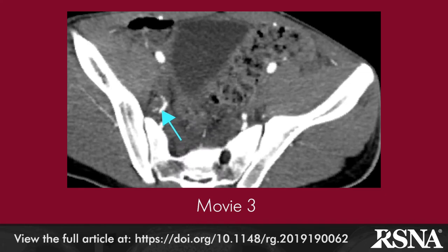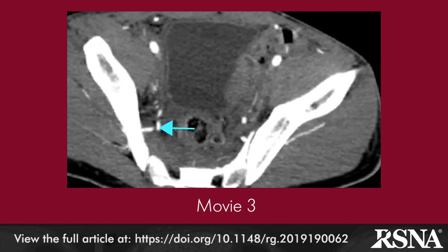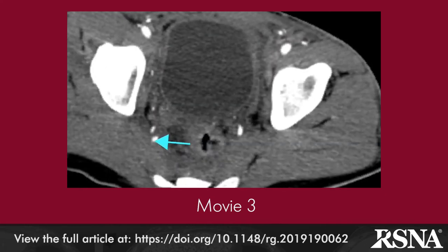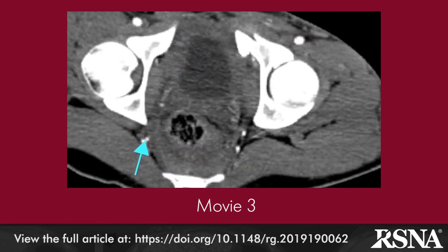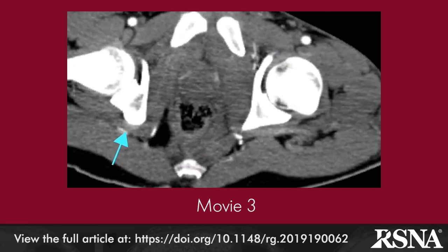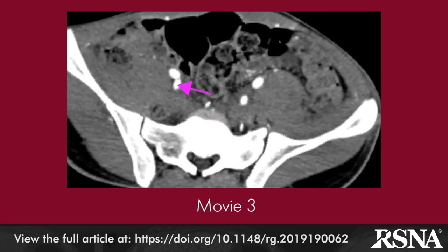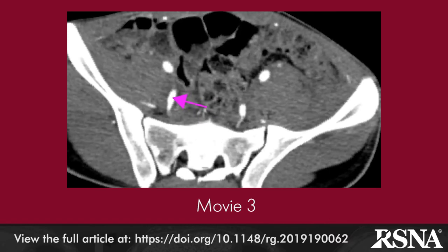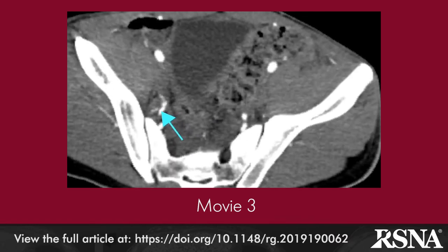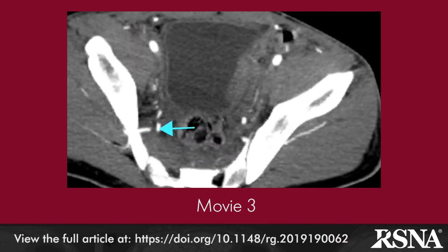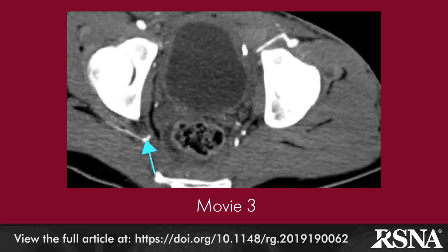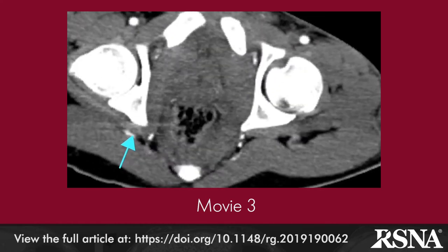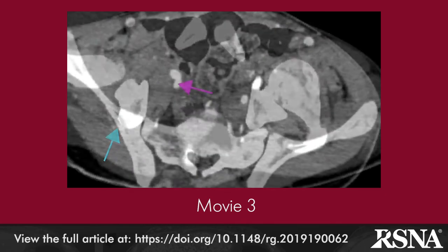Movie 3 covers the inferior gluteal artery anatomy. An axial maximum intensity projection CT of the pelvis in the craniocaudal direction in a 31-year-old man shows a colored arrow that follows the course of an artery arising from the anterior division in a downward and outward trajectory posterior to the internal pudendal artery. It exits the pelvis along the internal pudendal artery, beneath the piriformis muscle, above the sacrospinous ligament, and posterior to the ischial spine.